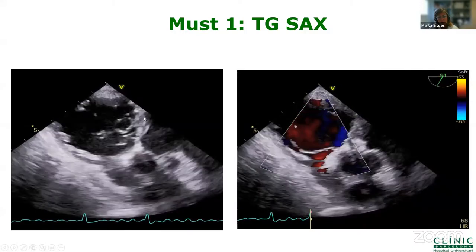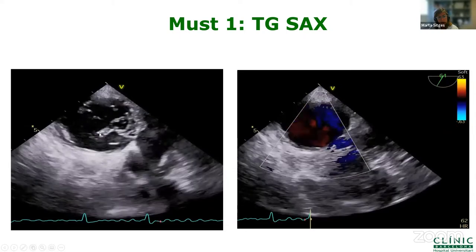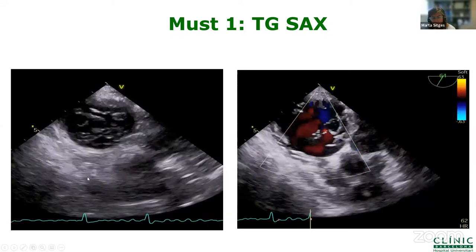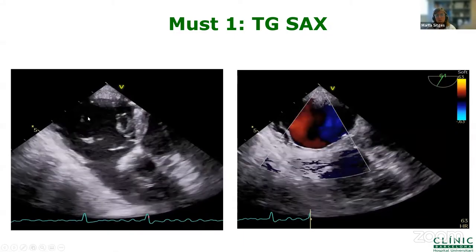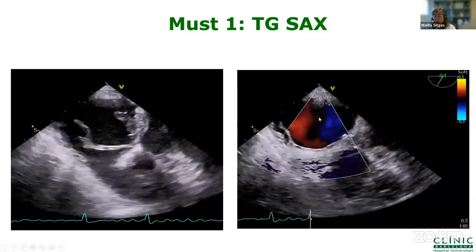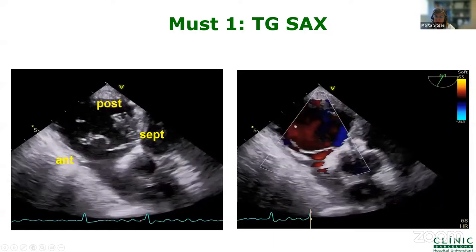And here it's the interventricular septum. So we have here the septal leaflet, we have here the posterior leaflet, and we have here the anterior leaflet that probably has here another indentation. There are some attempts to establish a classification according to the leaflets and according to the position of the anterior papillary muscle. But the important thing here is that you see the leaflets, that you see if there are commissures or indentations that may influence your strategy, particularly for TEER, if you're planning TEER. And also important here to combine with color Doppler, because you see the location of the origin of the jet. And also that, as you know, influences your strategy, particularly for TEER.